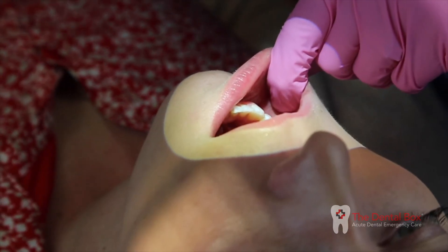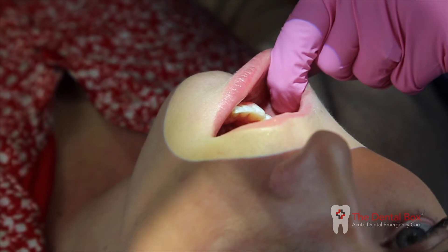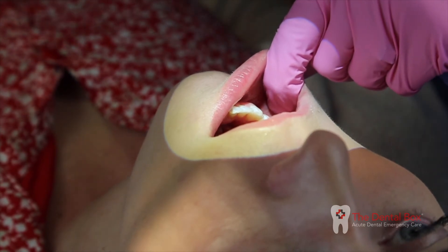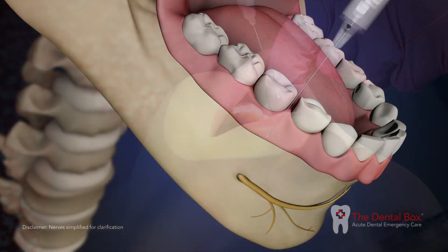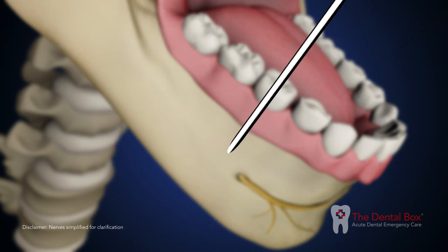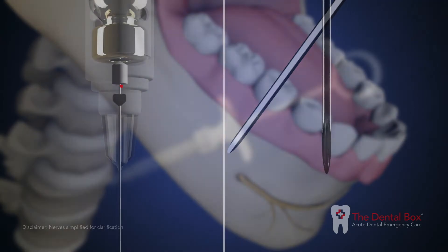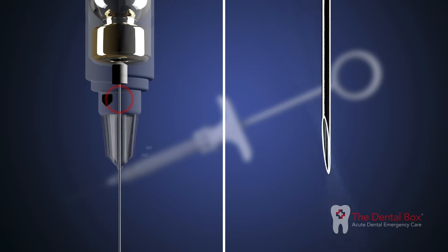With your left index finger, pull the lower lip and buccal soft tissue laterally to expose the site. Orient the syringe with the needle bevel toward the bone. The black marker on the syringe indicates the bevel location.